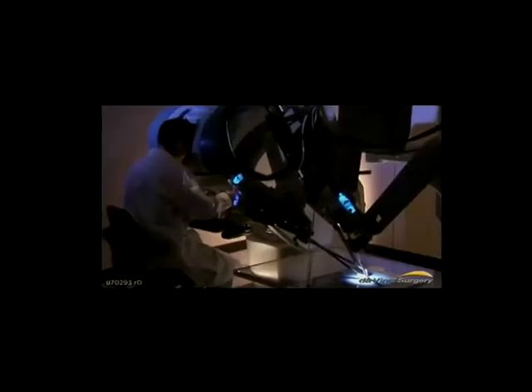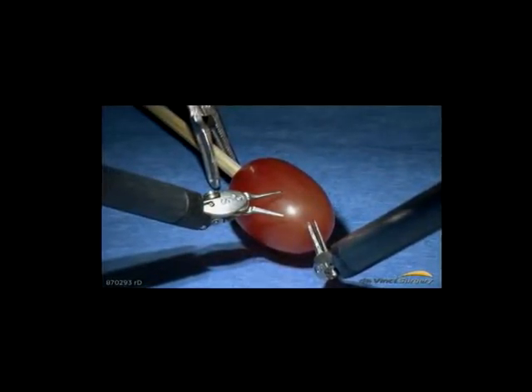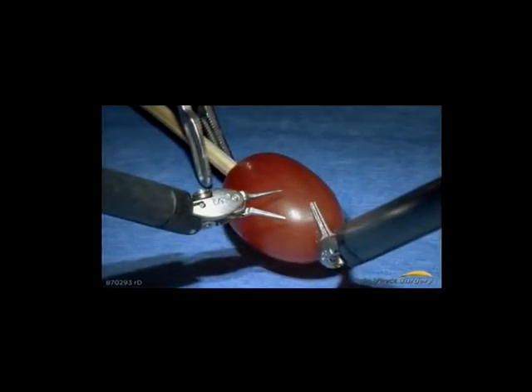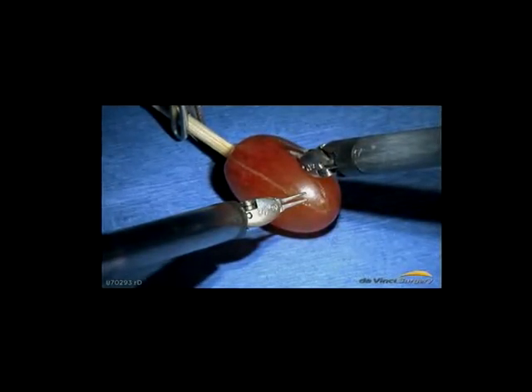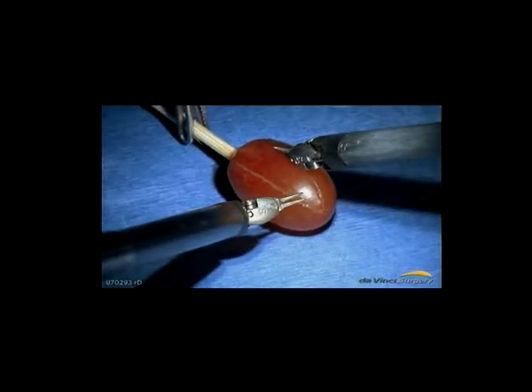Now, those in attendance were put in the surgeon's seat and allowed to operate. In this demonstration, operating meant using the small instruments to peel and reattach the skin of a grape, as well as stitch up a practice mat and pick up small coins. They ran the system through its paces, testing the system's safety mechanisms by faking sneezes and shaking their hands.